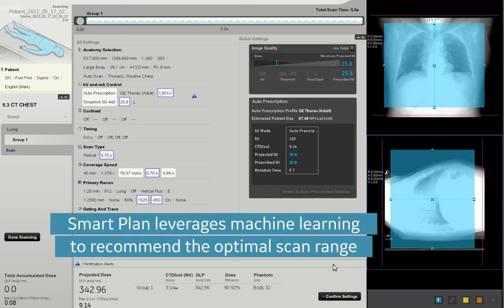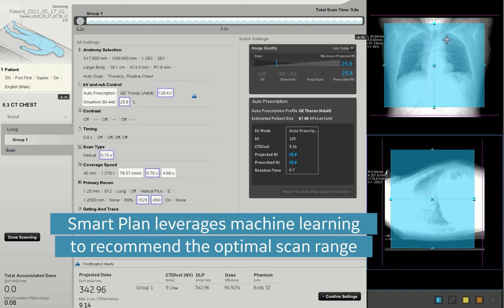SmartPlan leverages machine learning to recommend the optimal scan range for each exam, as viewed here.